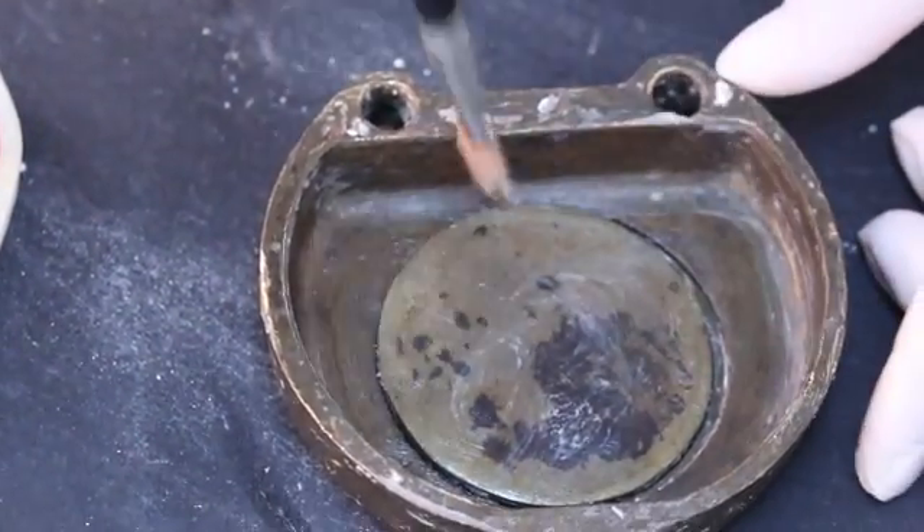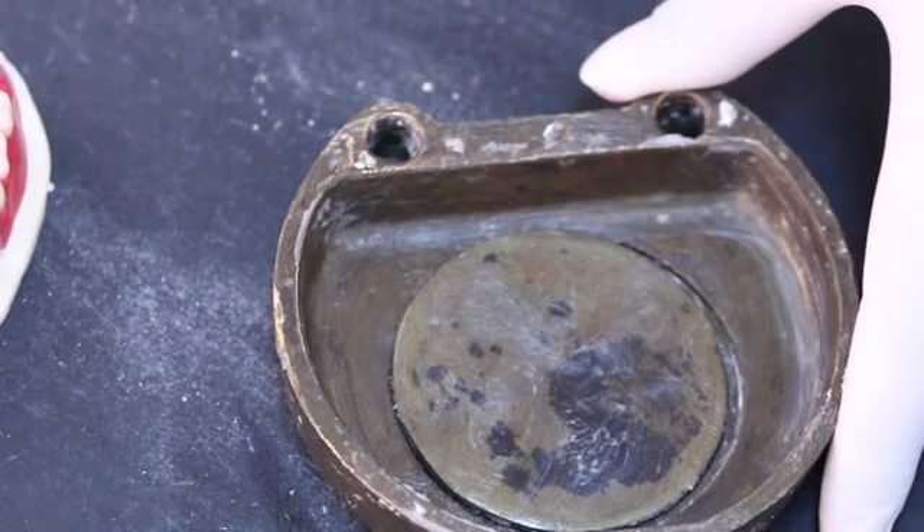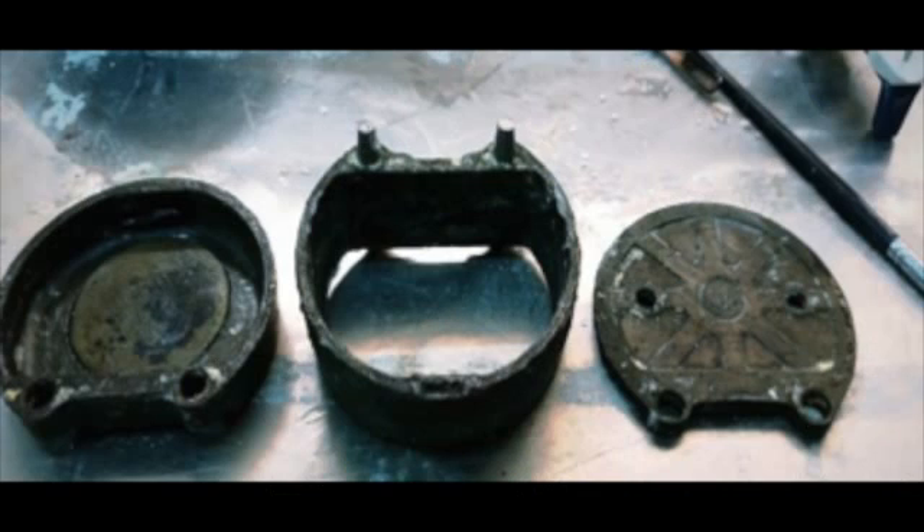A thin layer of petroleum jelly should be placed on the internal surface of the flask before beginning the investment process. This prevents pitting of the surface and facilitates removal of the stone mold.